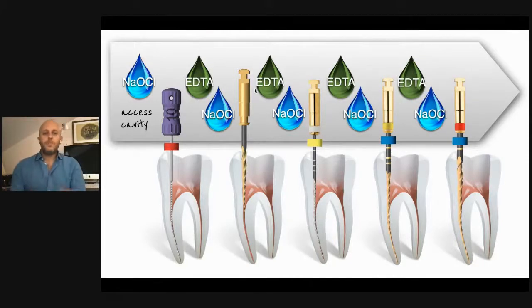I'm used to clean with EDTA in order to remove dentinal debris produced by the rotating file, and then I clean with the sodium hypochlorite, and I always work with sodium hypochlorite inside the root canal while the file is shaping the dentinal walls. Then I remove the file, I rinse with EDTA to remove the debris of hard tissue, and then I put new sodium hypochlorite. And also during these steps, I can intracanal heat the solution.